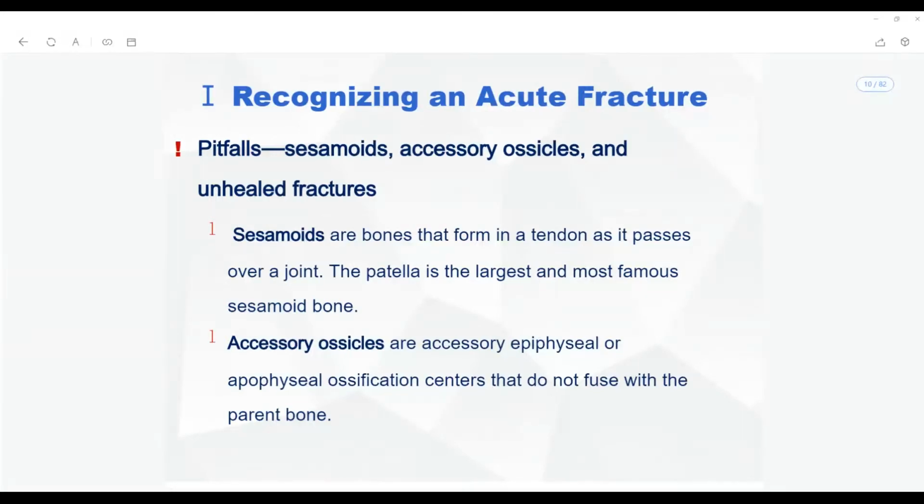So how can you say that there is detachment of the cartilage from a bone? Yes, MRI is the correct study. Yes, Benedict. Unless there is a complete disruption of the cartilage, there should be a lot of inflammation. Generally, where are the cartilages?